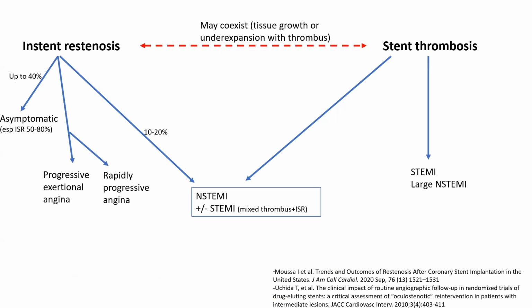So I want to give that slide, which shows the presentations of in-stent restenosis, stent thrombosis, and how they overlap. Stent thrombosis is clinically more dramatic, usually, than stent restenosis, and often presents as a STEMI or large non-STEMI. However, in-stent restenosis overlaps with that presentation for a couple of reasons. One, in-stent restenosis, even without any thrombus, can be severe enough, and in 10 to 20% of the cases, up to 30% in some registries, it can present as non-STEMI.